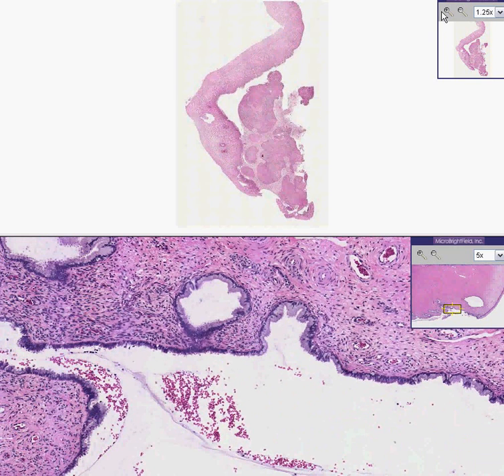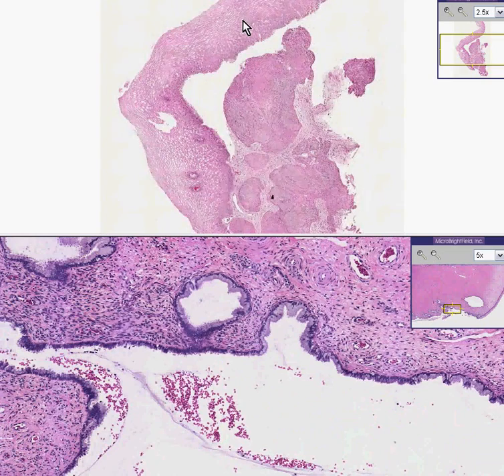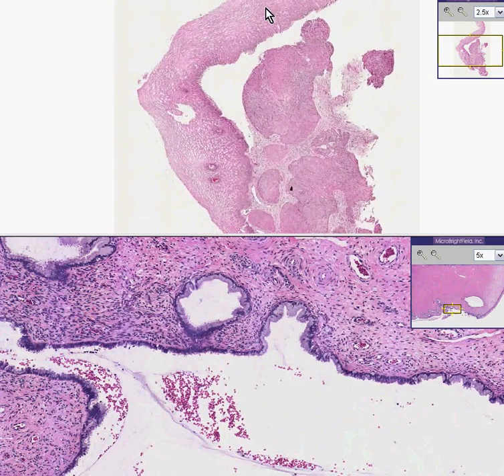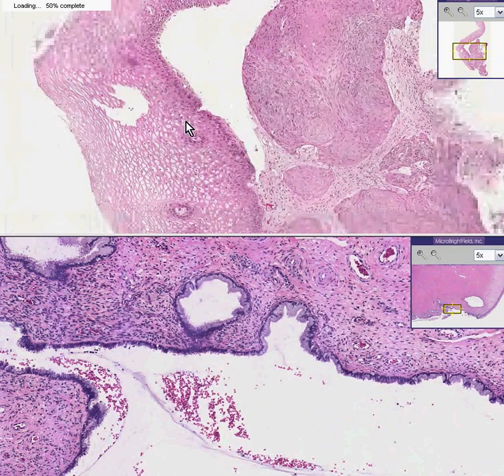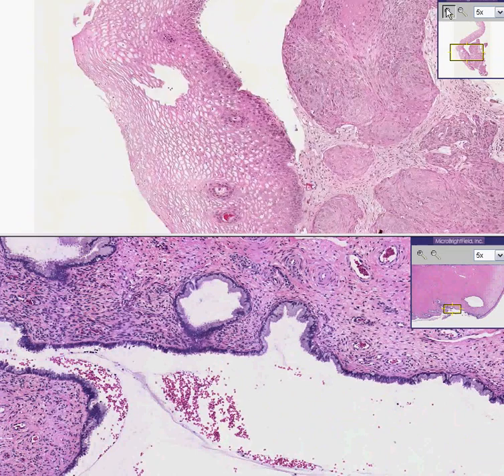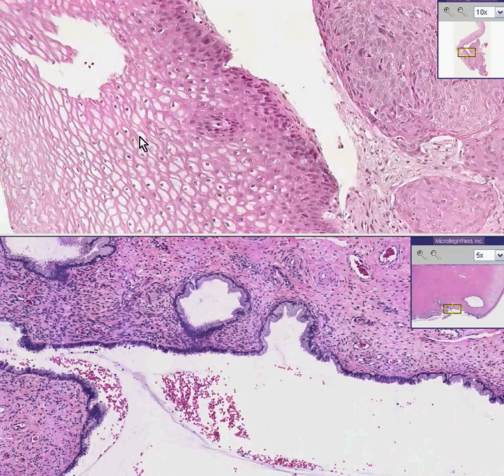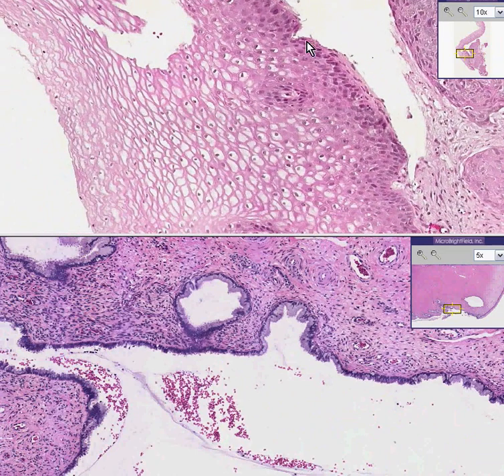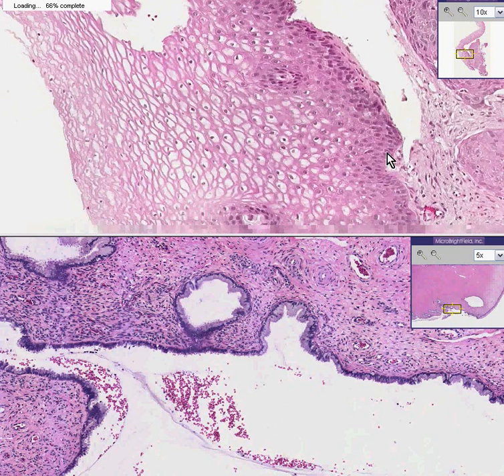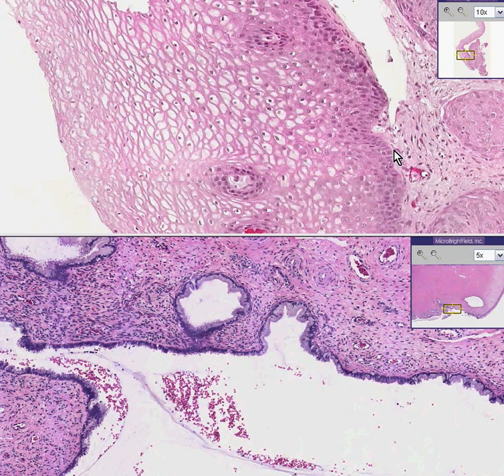Let's look at the upper lesion because we have a problem here. You can see that we have a little strip of squamous mucosa in which, even though there's no stroma underneath — perhaps here there is — you can see good maturation from these little tall soldiers, the columnar cells at the bottom, going out to these flat cells at the top.